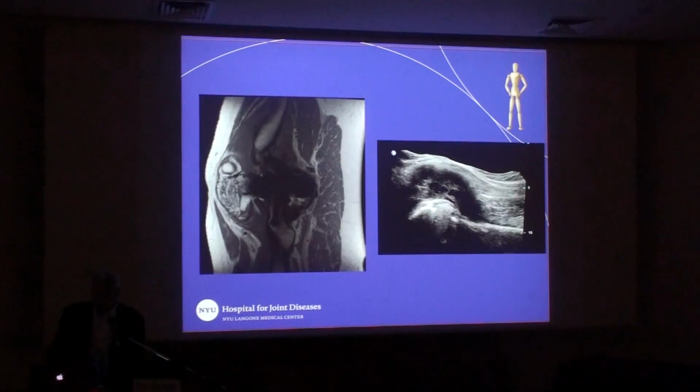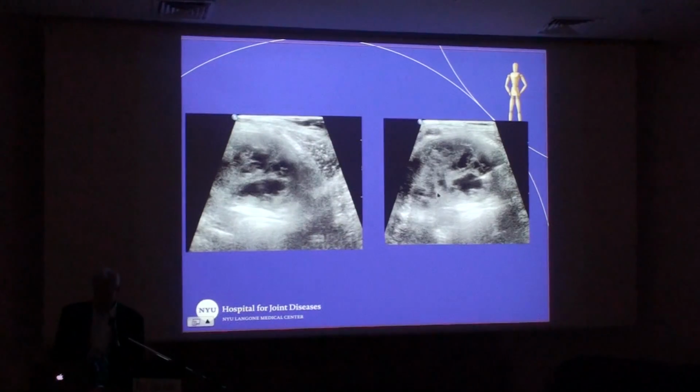And you can see this is a sagittal image showing what this would look like on MR. I can get my arrow over here, so that's that. Notice that there's a lot of susceptibility artifact over here. If you look at the corresponding extended field of view image on ultrasound, you see the characteristic artifact due to the fact that there's a metallic femoral component, but notice that there's no difficulty in seeing the overlying distended bursa. And so we were asked to aspirate this.